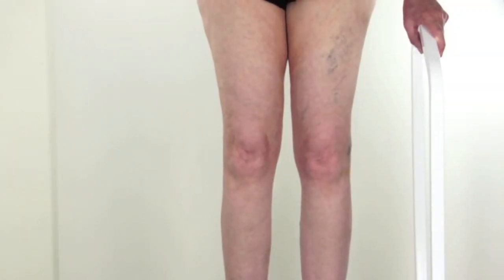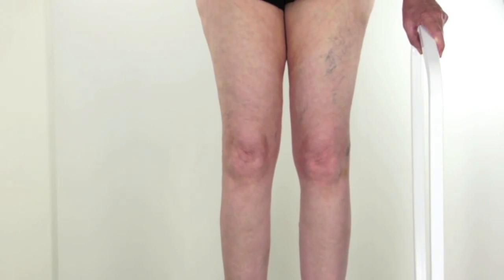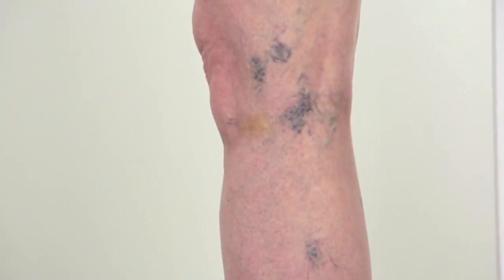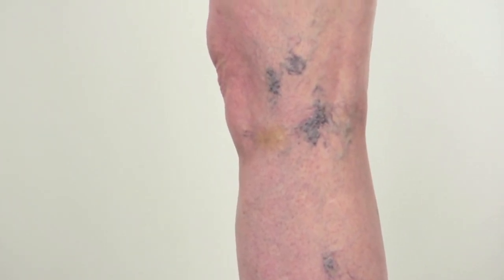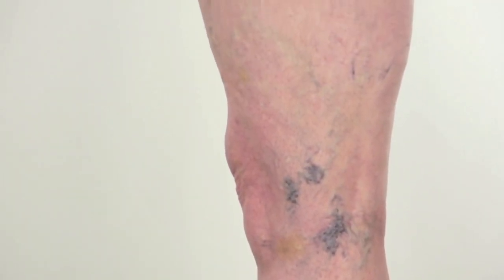Examine the patient carefully standing. Look carefully for thread veins, reticular veins, varicose veins, and other signs of venous disease.